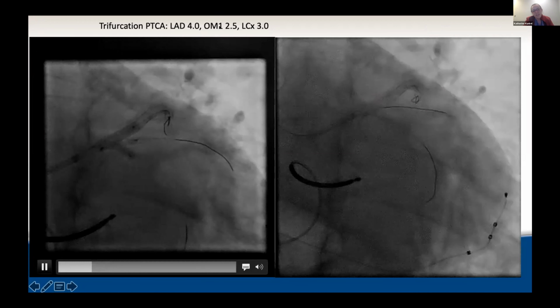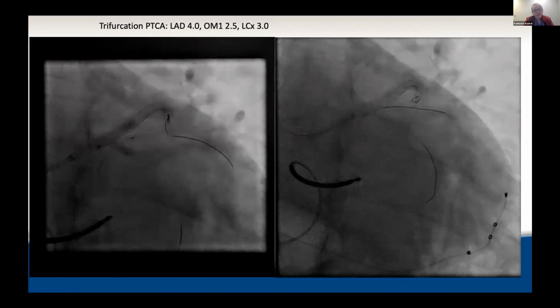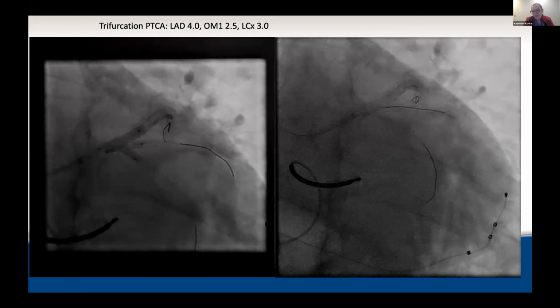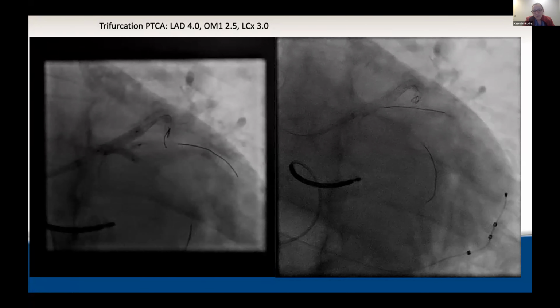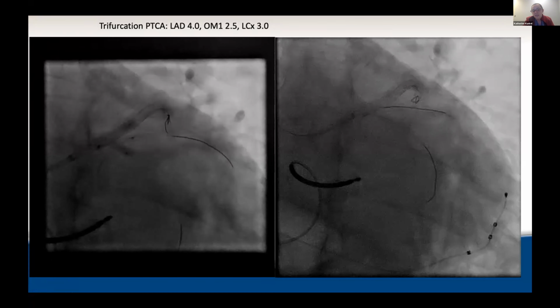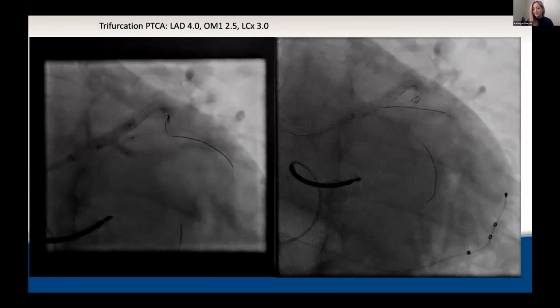I just wanted to point out, we actually downsized a bit here compared to what we had been using because we were doing trifurcation ballooning and didn't want to overinflate the left main. I don't know if anyone wanted to mention their thoughts on sizing. Also, we were radial through a 7 French and we got all of these non-compliant balloons in at the same time through a 7 French. I was just about to ask that. I think you guys are radial. Yep.